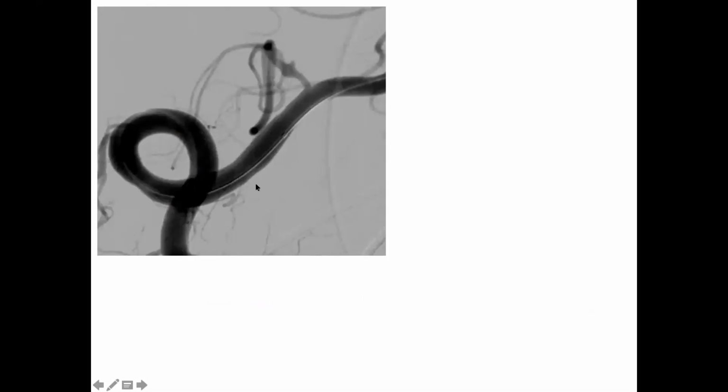When I decided to put the microcatheter with balloon here, the problem is when you remove the guide wire supporting the catheter, it is possible that you go out with the stent. I decided to use a balloon to protect when I detach the stent. This is the vertebro-basilar PICA aneurysm.